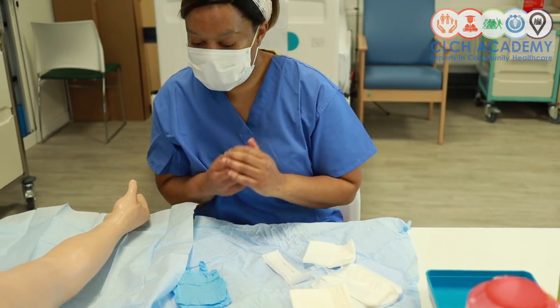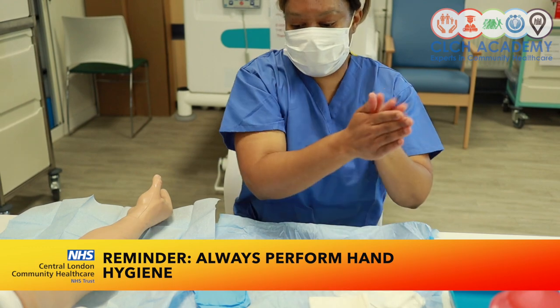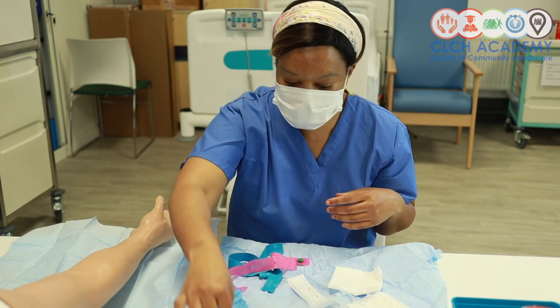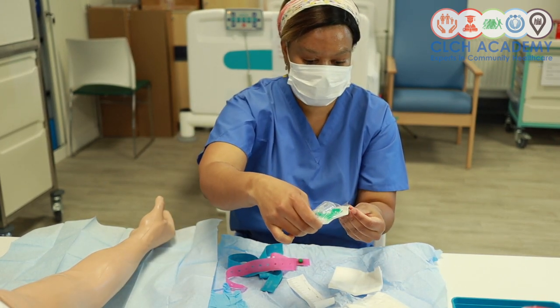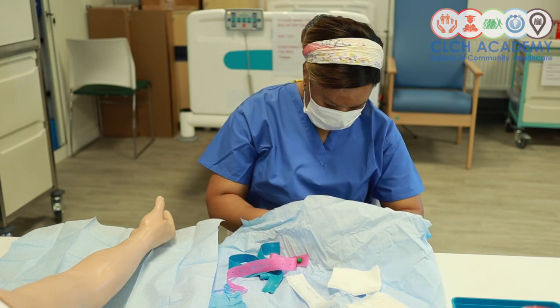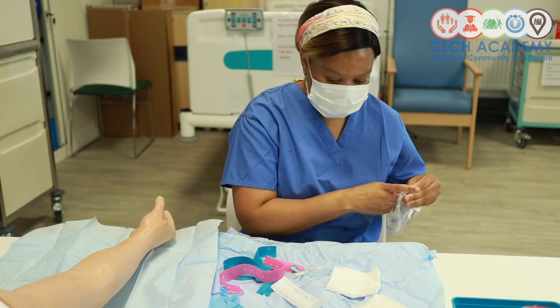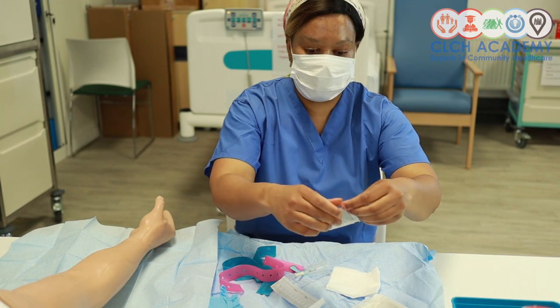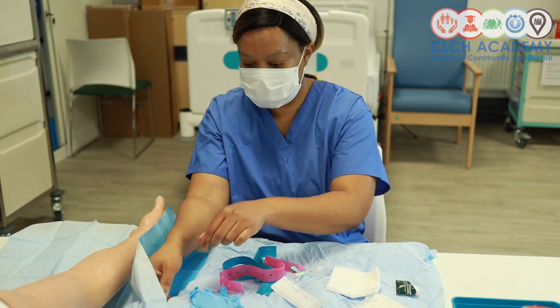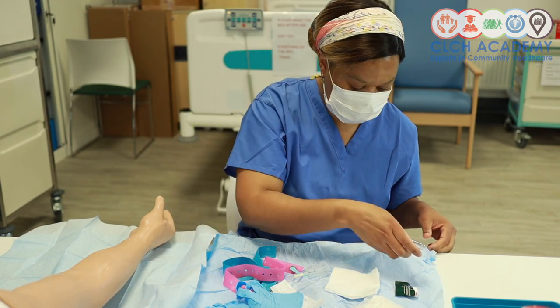Okay. So I've cleaned and decontaminated the patient's skin. However, before I get any equipment ready, I'm going to apply alcohol to my hands again. Two tourniquets. Quick shield device, in case I need one. And selection of bottles.